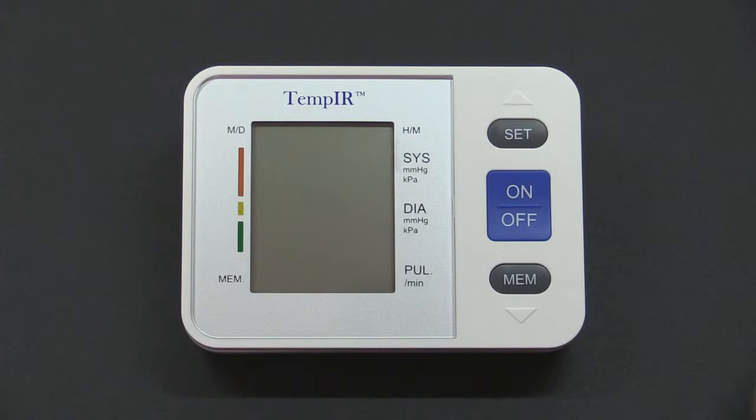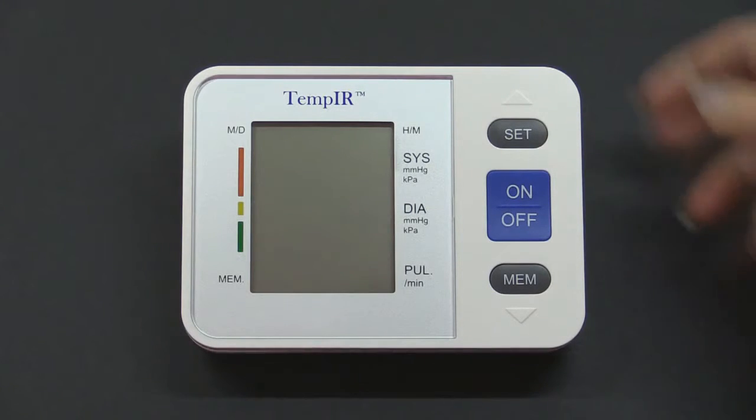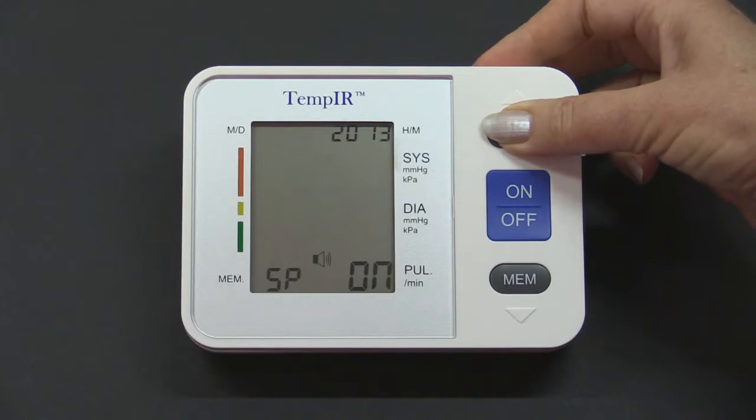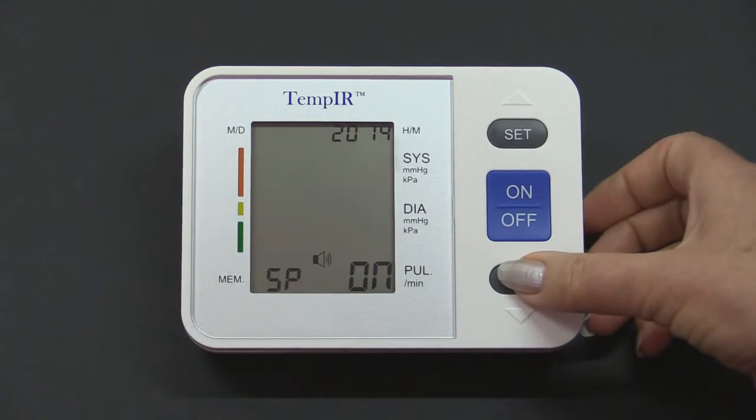To keep a record of your readings, it is necessary to set the date and time. To do this, press and hold the Set button until you see the year flashing. To change the year, click the Mem button.